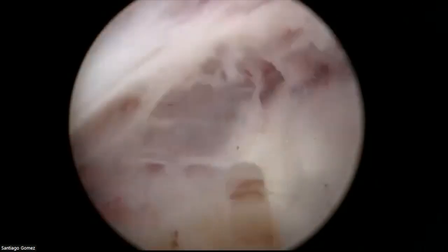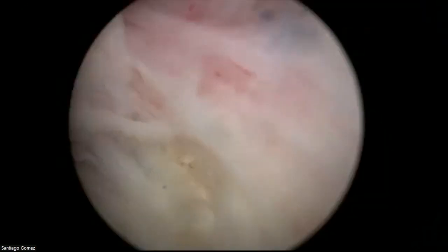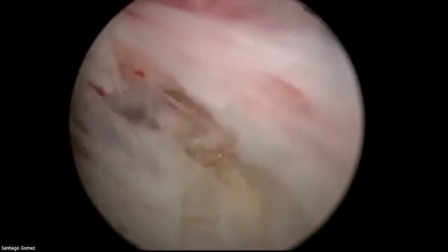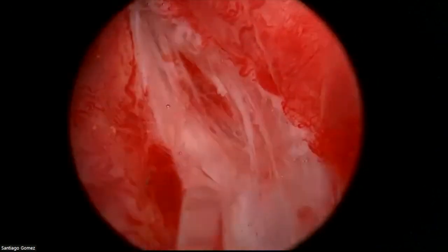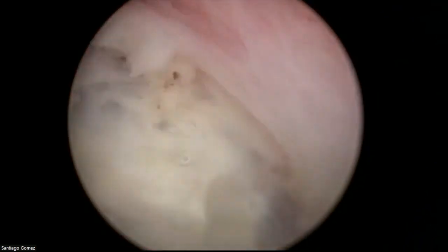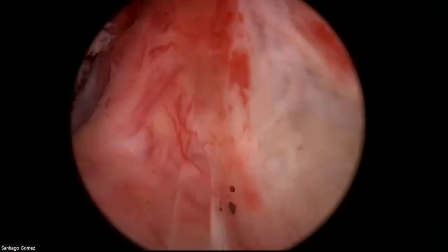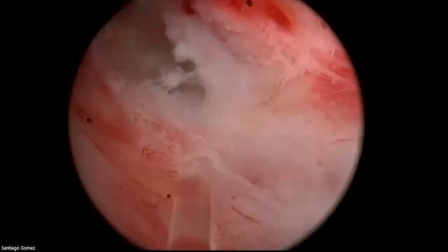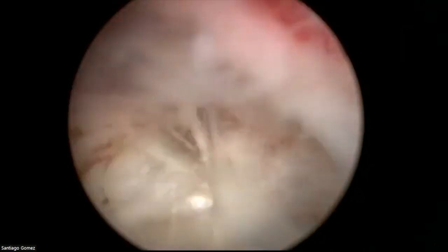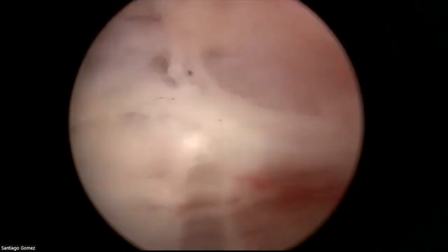And as I said, I will elaborate more. And I think we can discuss the other practical issues later on between patients, if that's okay with you. So here I'm going to focus more on technique while we do the operation. Okay, so here I'm going to enter as well to look for the proper plane. You see that I'm going to the floor of the veromontanum. This is veru, so I'm coming down here. Often I like to come all the way to the white line and release also these fibers here, because that will reduce the amount of traction that the apex is going to receive from the dissection.